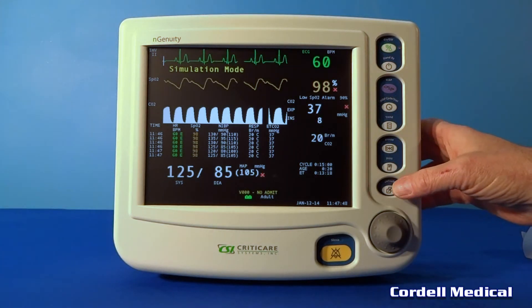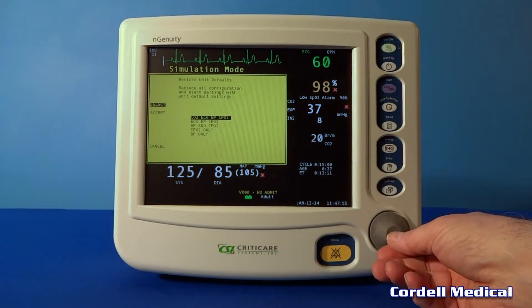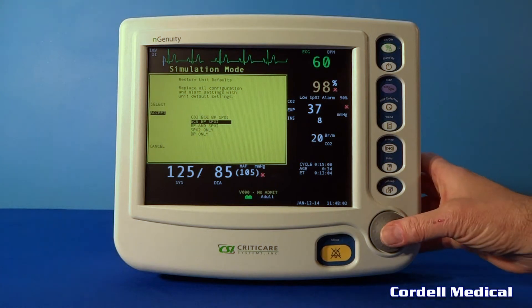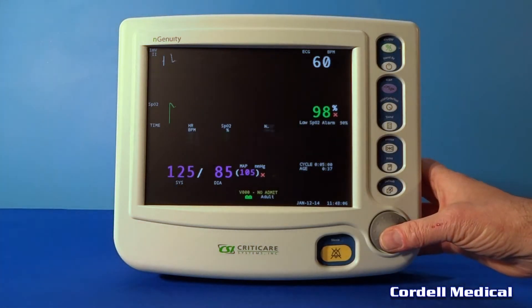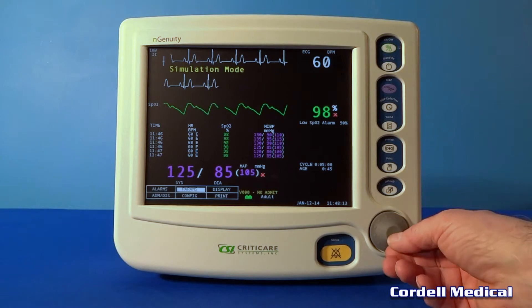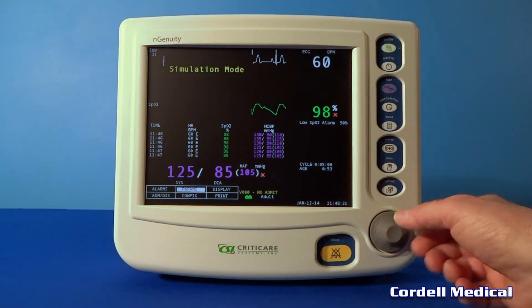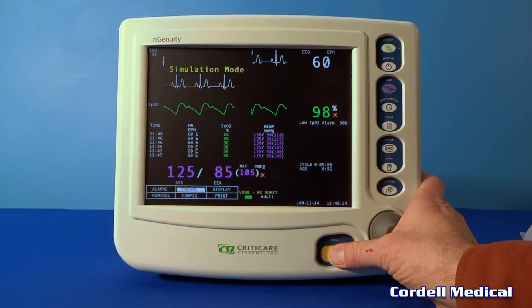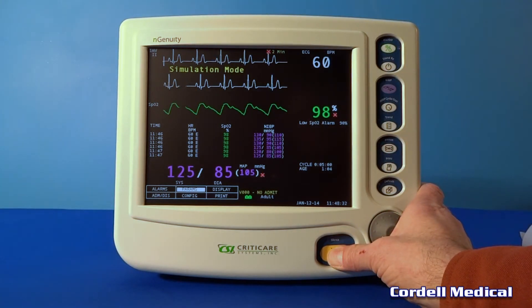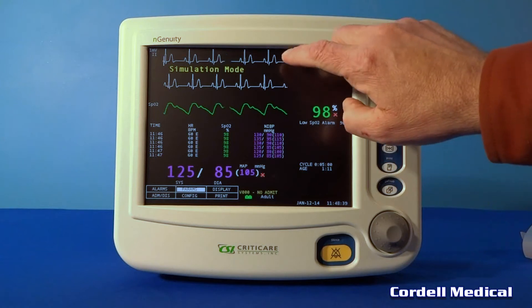Press the default key momentarily to access the custom default profiles. Here you can move between profiles and accept whichever one you desire. Press the silence key momentarily to begin a preset time of alarm silence — right now it's set at two minutes. Press and hold the key to permanently silence the alarms, shown by the infinite sign above. Press the key again to resume normal alarms.